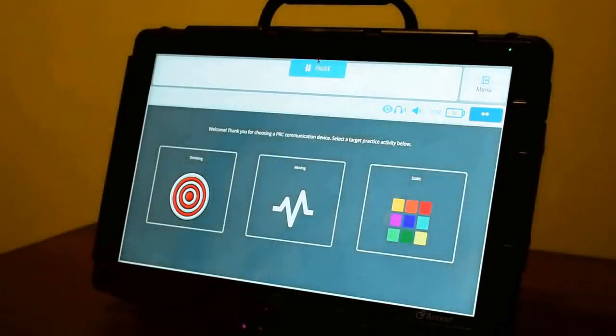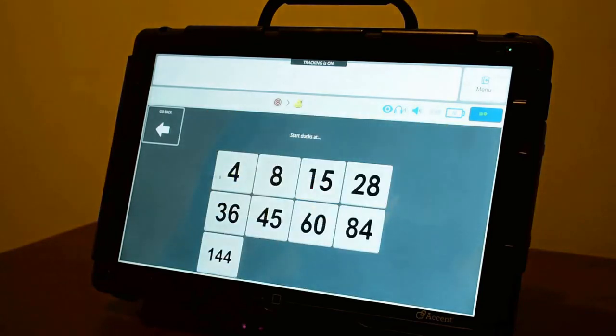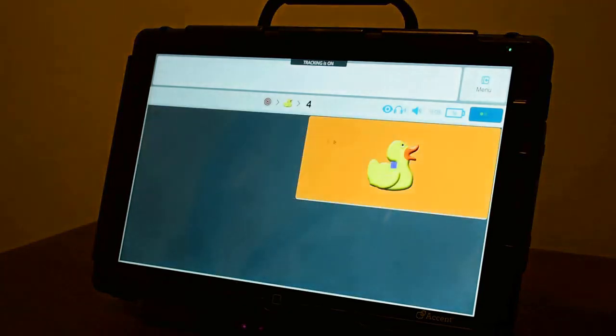So now this is a lot of feedback. I wouldn't typically recommend this, but this is just to show you I have a cursor. I have something that happens at the point that I start to dwell on a button, and then it inverts when I select.